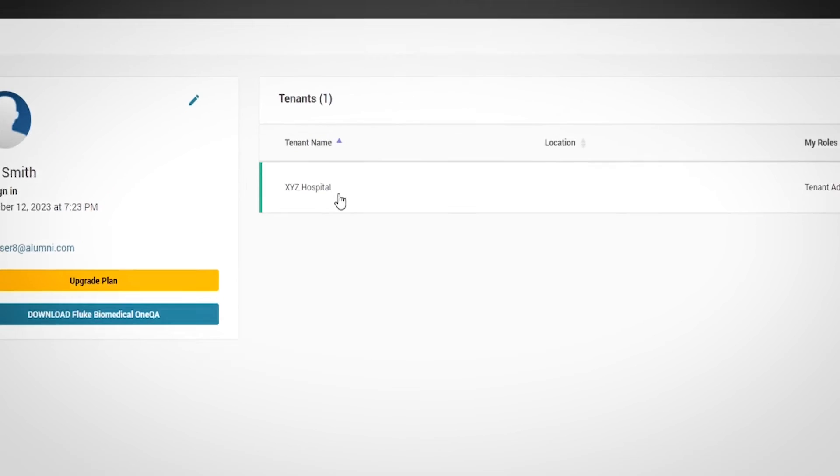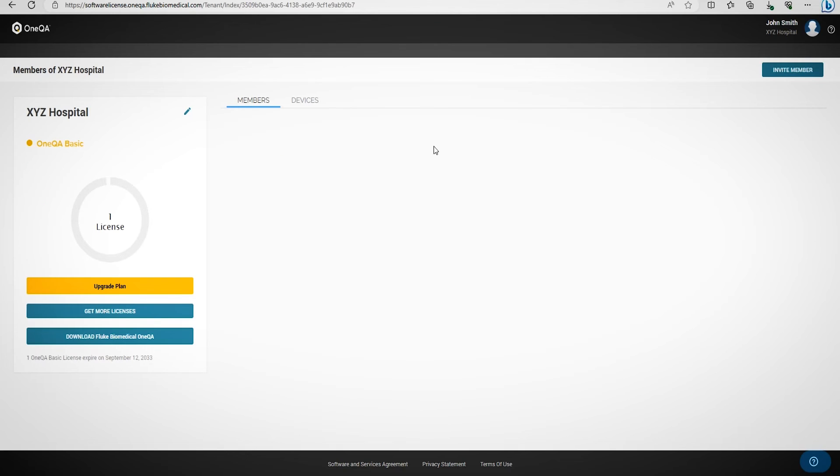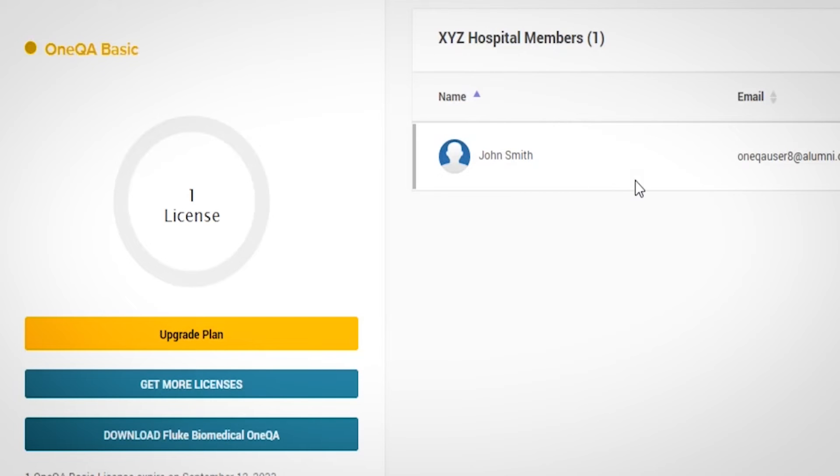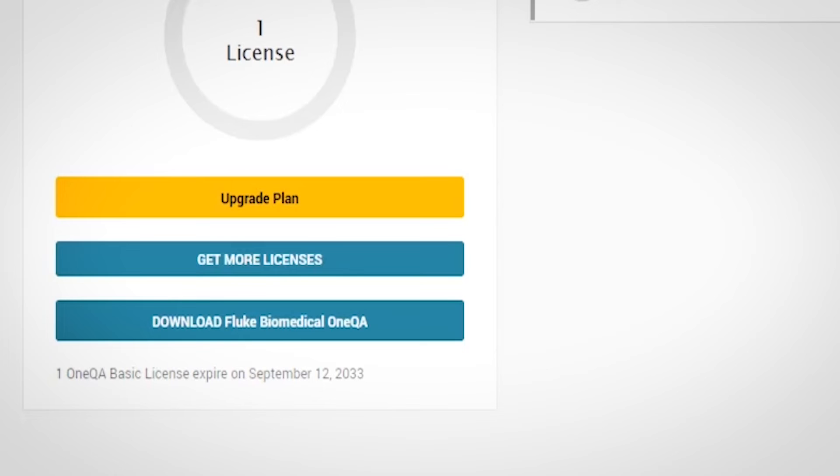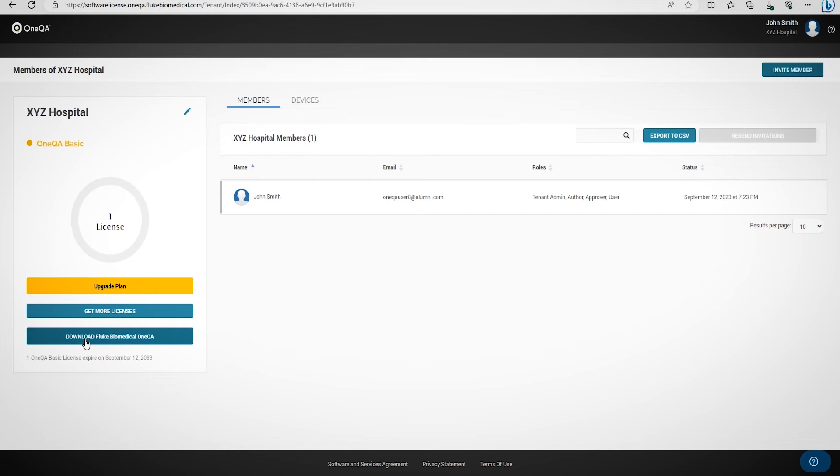By clicking on the tenant name, you can access the tenant and view its contents. In this case, we have one license for OneQA at XYZ Hospital. If you ever need to re-download Fluke Biomedical for any reason, you can do so directly from the licensing portal. If you have multiple computers, simply log in to the licensing portal and download Fluke OneQA.